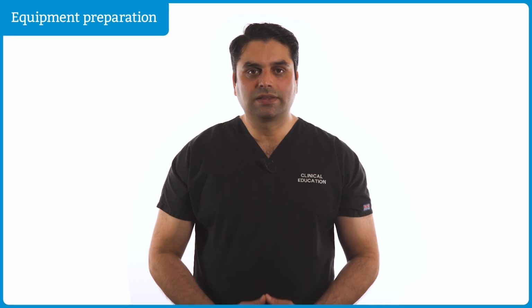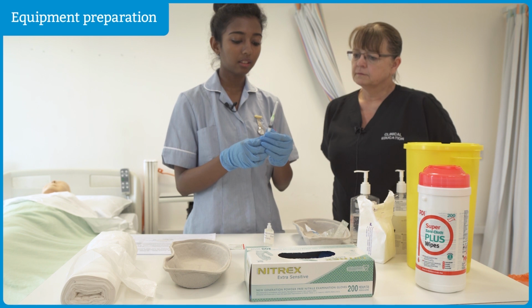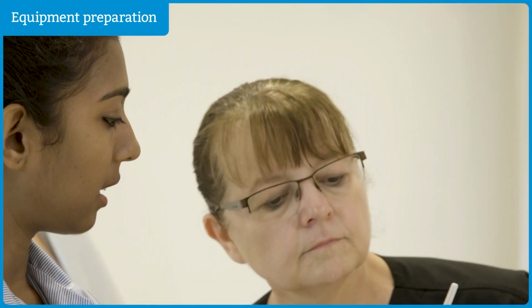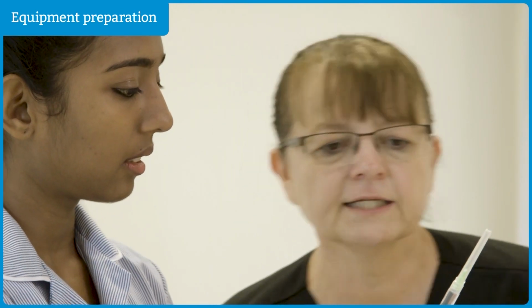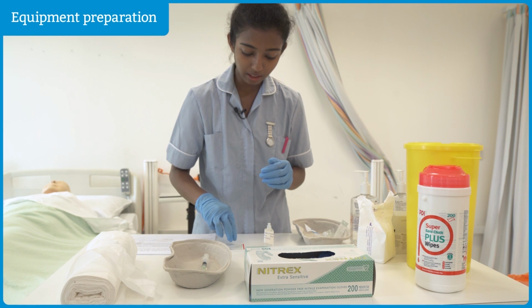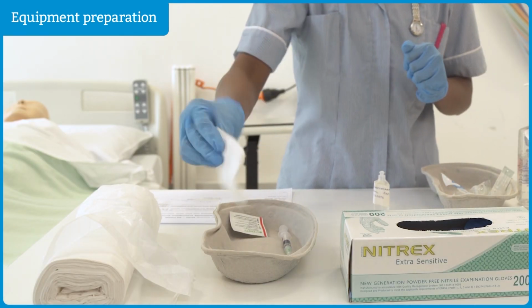Show the assessor that the dosage is correct and there are no air bubbles. So I finished loading the medication, and I need to show it to the examiner. It's 1 ml and no air bubbles. Yeah, that's correct. Continue. All right. So I'll be putting it into my clean tray. Place the syringe, gauze and alcohol wipes in the clean tray and take to the patient.